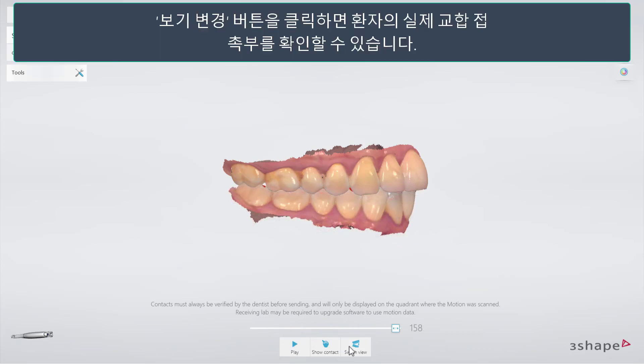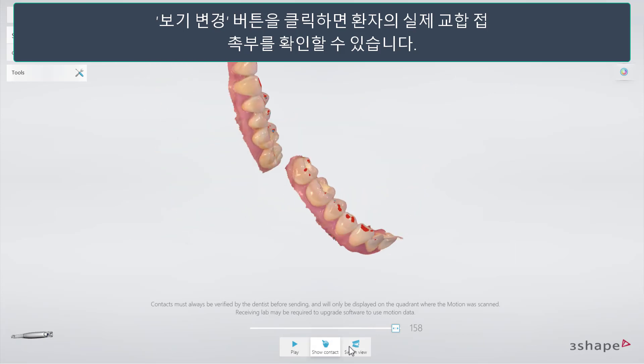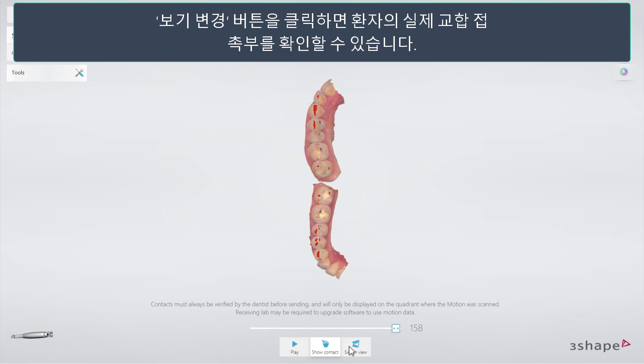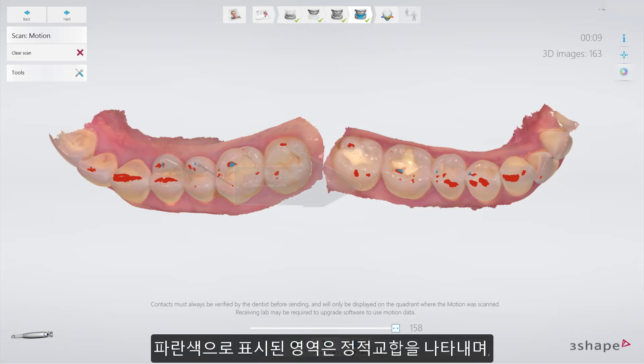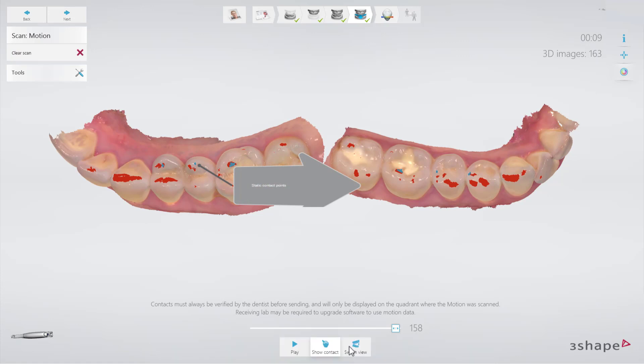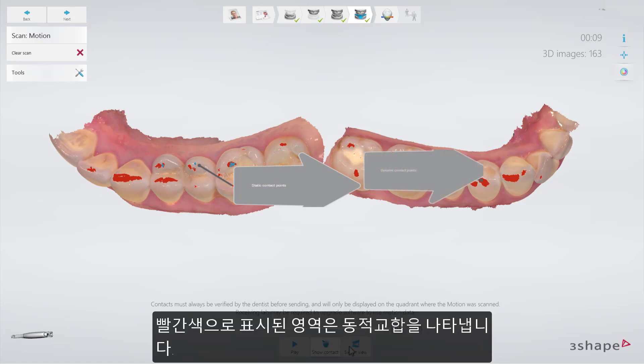Select the Change View button to view the actual contact points of the patient. The blue marked areas will show the static contact points, while the red marked areas show the dynamic contact points.